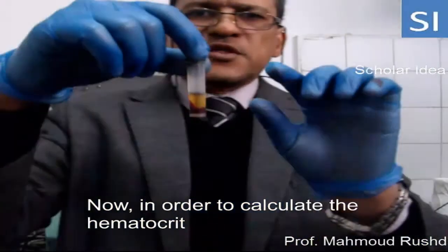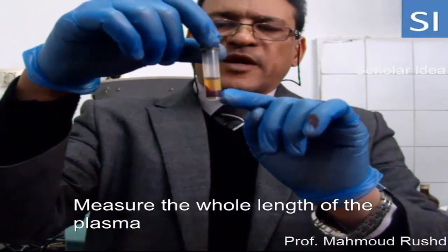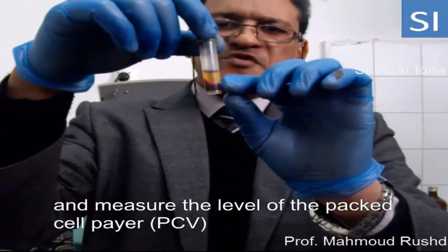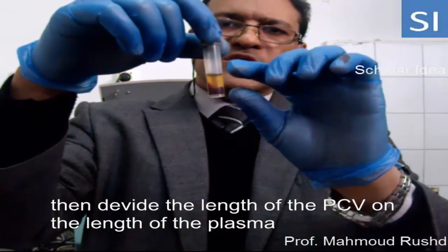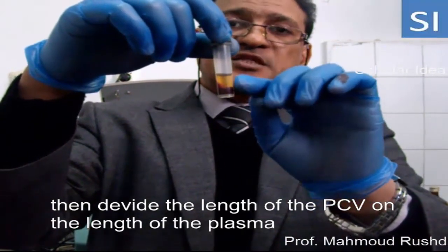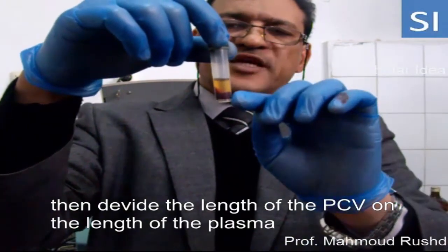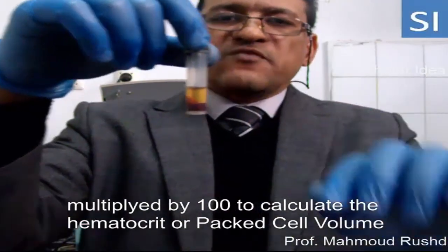Now, in order to calculate the hematocrit, measure the length of the plasma and measure the length of the packed cell layer. Then divide the packed cell layer by the whole length — the length of the packed cell layer and the length of the plasma — multiplied by 100 to calculate the hematocrit.